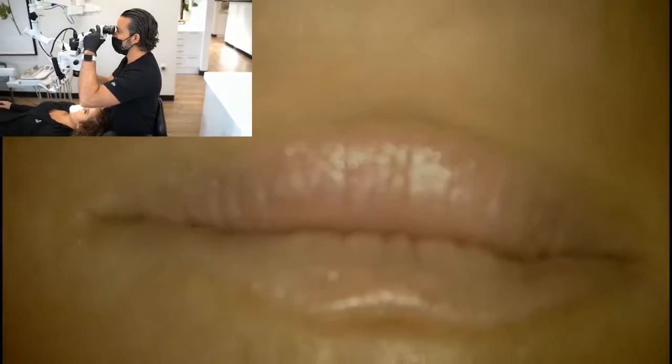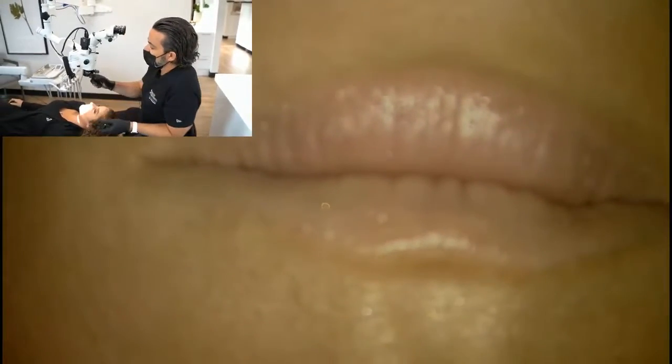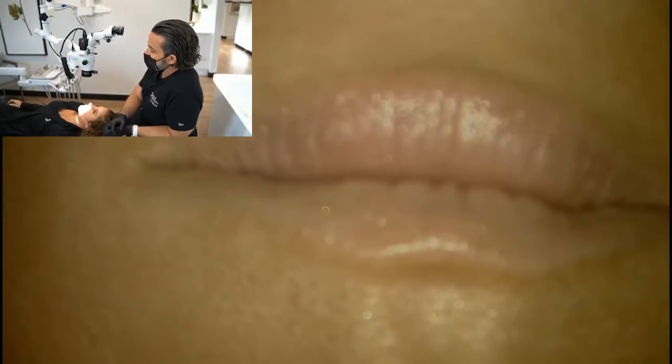I'm only 5'9", but I've learned to work at a full 350 millimeters of working length here. This is a variable focus microscope, so I can go from 200 to 350, and so there's a lot of play between practitioners. There's a lot of height that you can do if you have different people working in your operatory, and so that's one thing, is to get a variable focus lens.